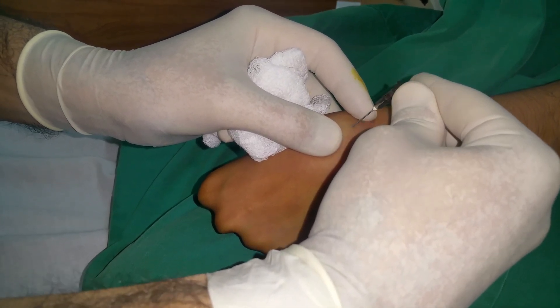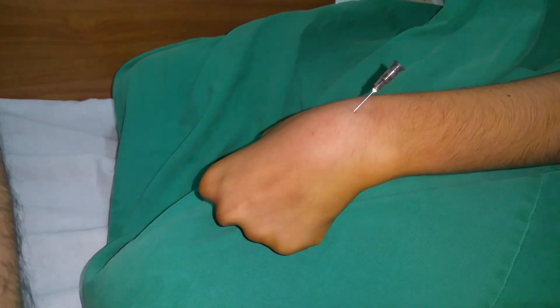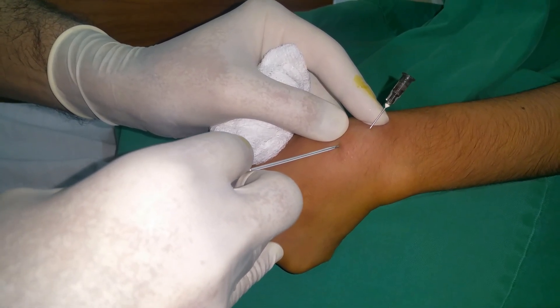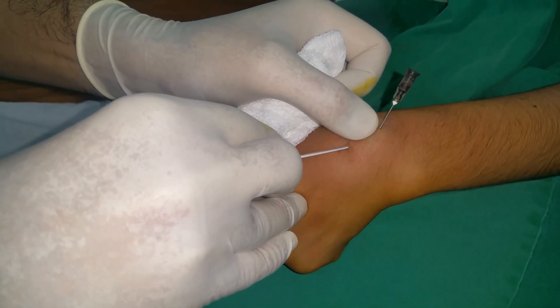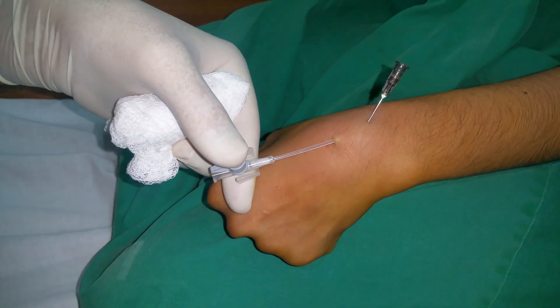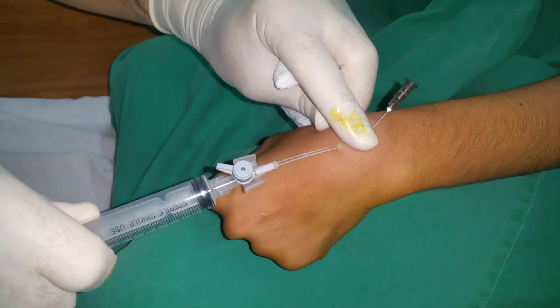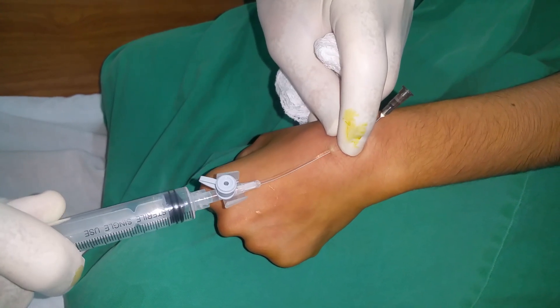We are in the space and now initially we will evacuate it using a wide-bore cannula, which in this case is 16 gauge. We are in the right space. We have introduced it and confirmed we are in the right space.